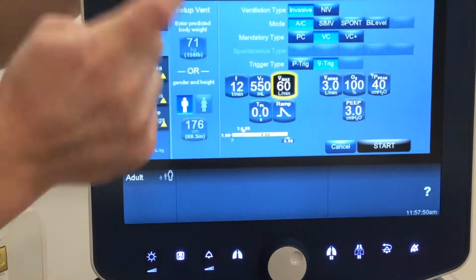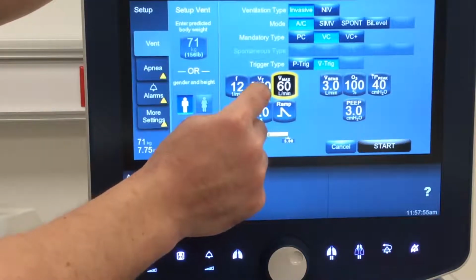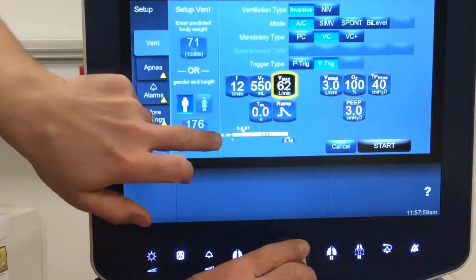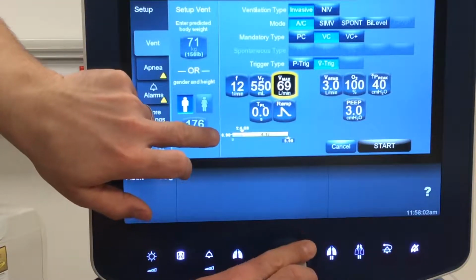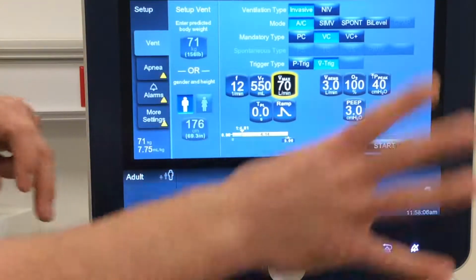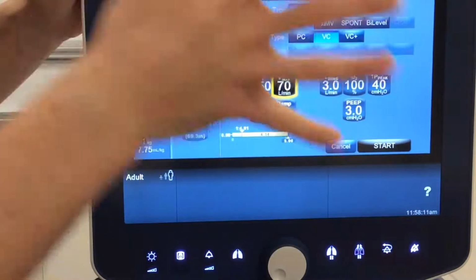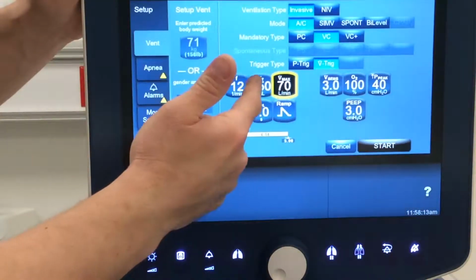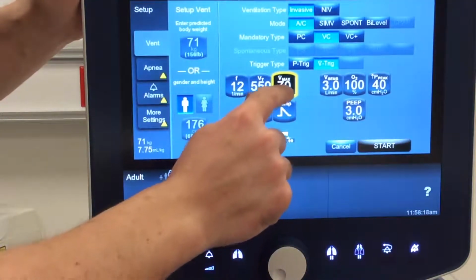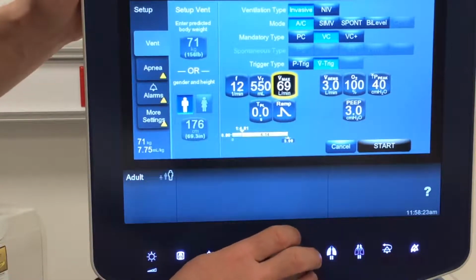So this brings us to our first core relationship. By me setting my tidal volume, as I start changing my peak flow, what we see happen is it changes the speed at which I reach my volume target. So think about it. This is us squeezing the bag. If I squeeze it really quickly or I squeeze it really forcefully, the flow coming out is faster, and what happens? I reach my target volume, or I reach my chest rise a lot more quickly. So flow is, in essence, indirectly setting our inspiratory time.